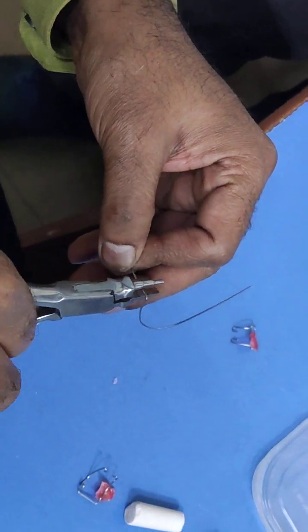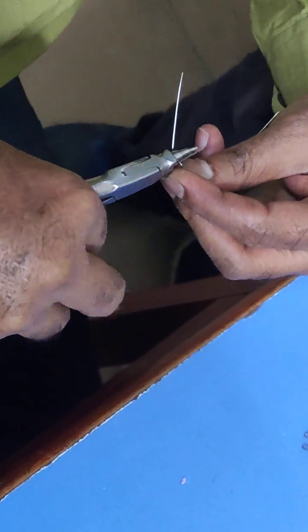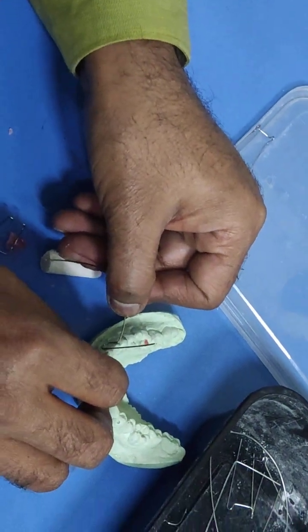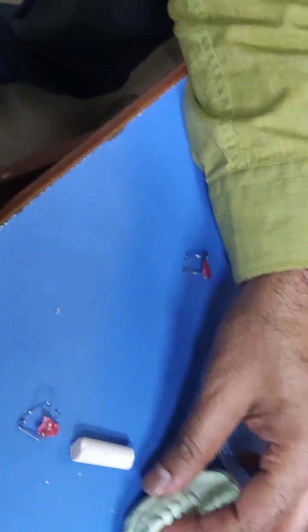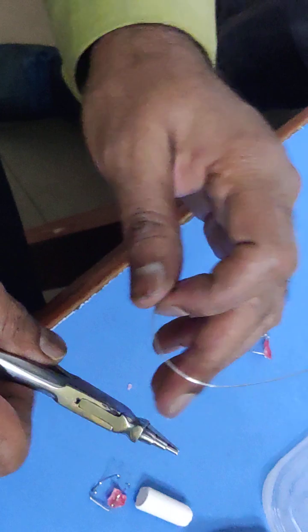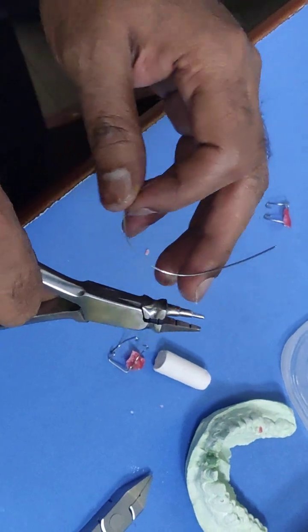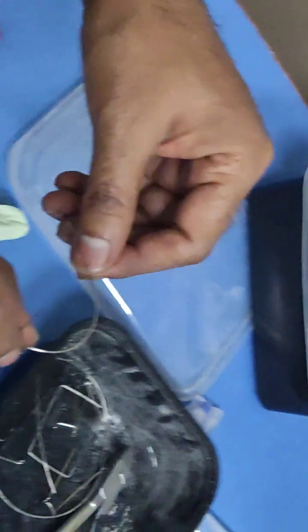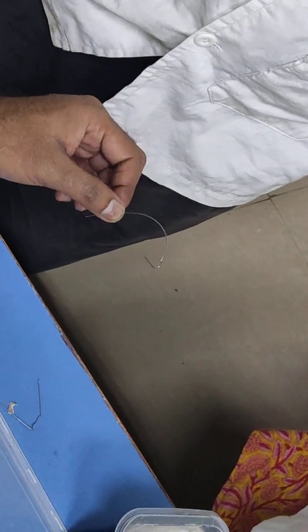And the width actually depends on the width of the associated tooth. You see, almost the same width as the canine. In that case, better hold or bend the wire at the widest portion of the plier. Better. So now what happens? If you check it from this side, it looks like the U-loop is bent inward. So first make it outward.